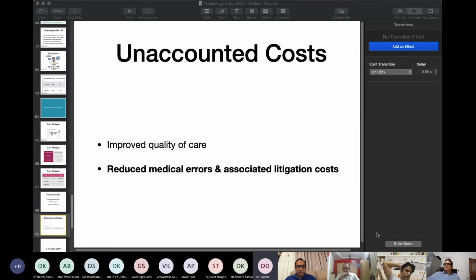Suppose anybody wants to go for neonatal, that one. And touchscreen monitors have come; almost all the monitors have a touch screen. Even with the touch screen, I think Masimo is 7 seconds, and there are many other machines showing in 4 seconds.